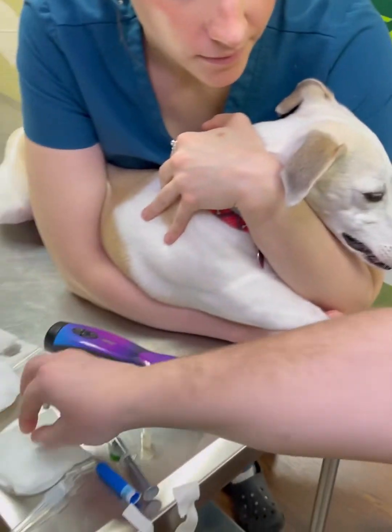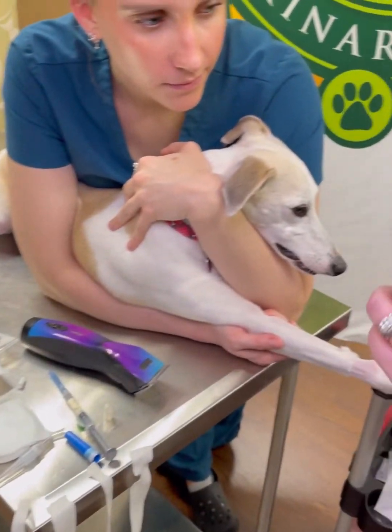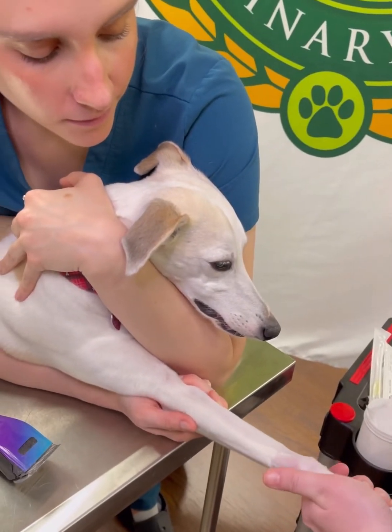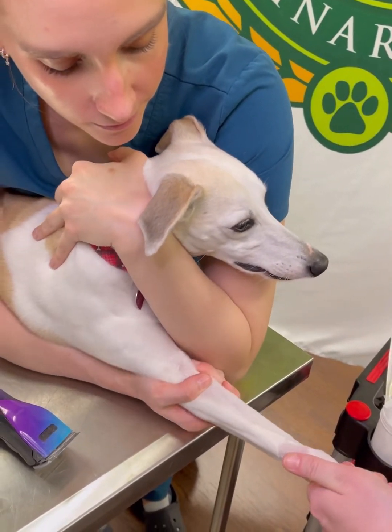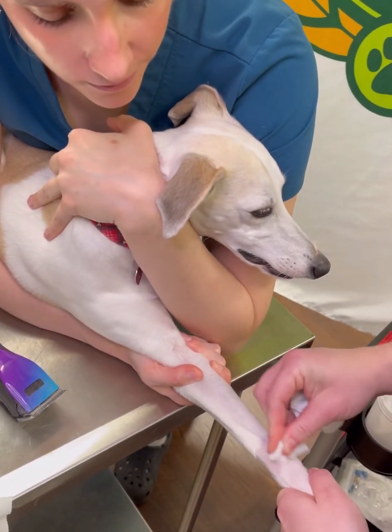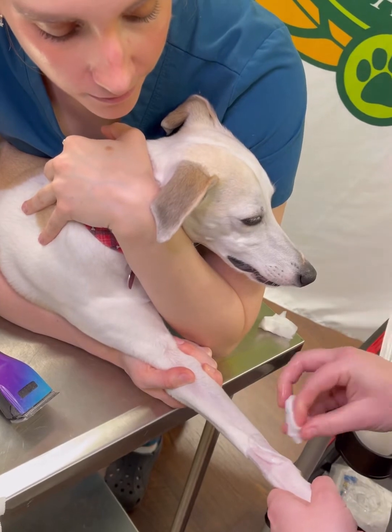Now you're ready to scrub. I'm going to start with one scrub, get all the excess hair off, and Madison's going to hold off for me. She's going to roll her thumb over the dog's vein, and I'm going to start scrubbing the area I'm going to poke, being sure not to touch the hair around it.